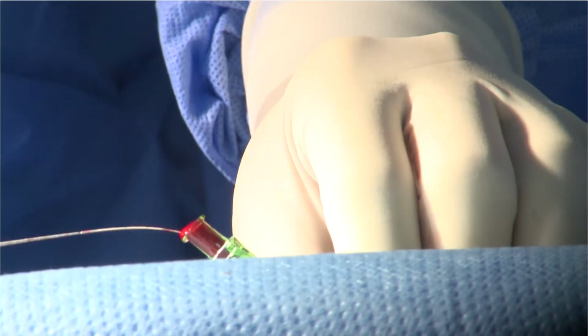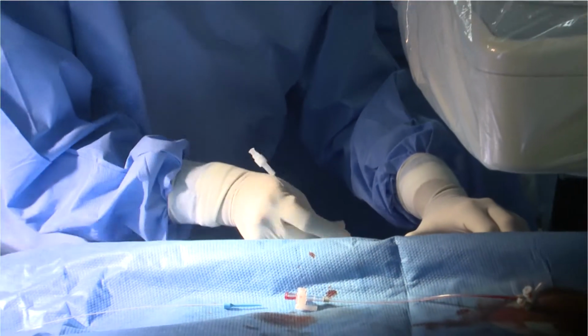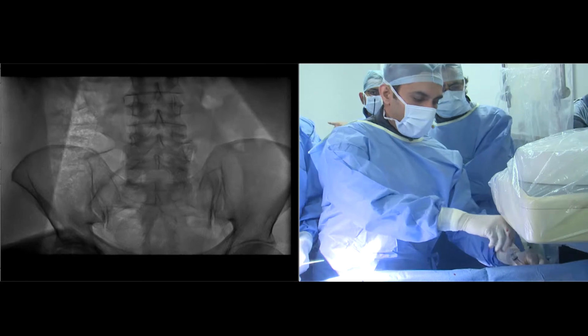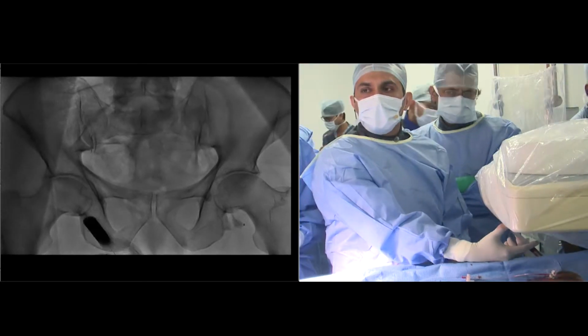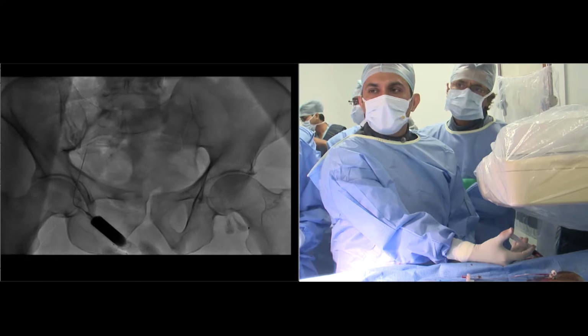The micropuncture is a 22 gauge needle with an 018 wire, and this is a 4 French sheath. So we'll take access. We'll do a femoral angiogram after that. This is a micropuncture sheath in the right common femoral artery. We'll take a femoral angiogram. Show down. Good, good. Go RAO. Good. IA down.